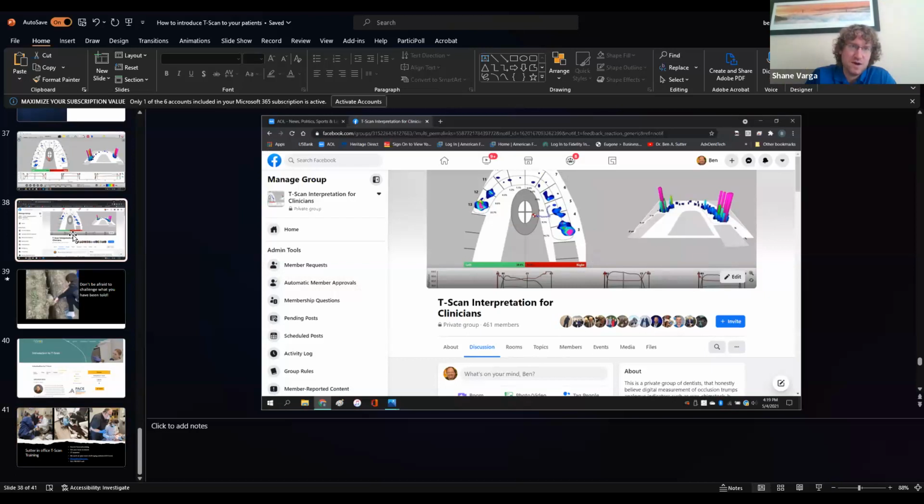Here's a question: how is OccluSense different than T-scan for a non-TMD patient? Yeah. I was excited when OccluSense came out because it was cordless and they had ink impregnated on their sensors, so maybe you're saving a step. And the sensors were thinner. I worked for about 2 months side by side, because T-scan is the gold standard.